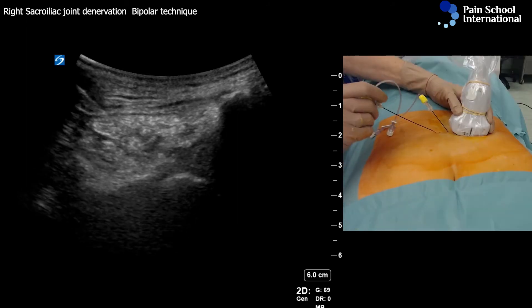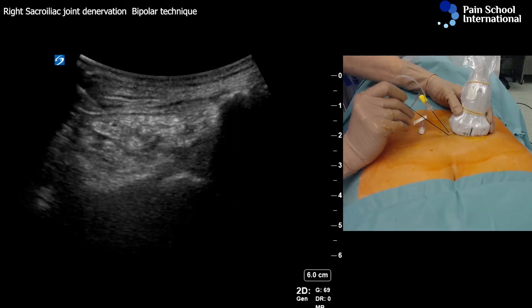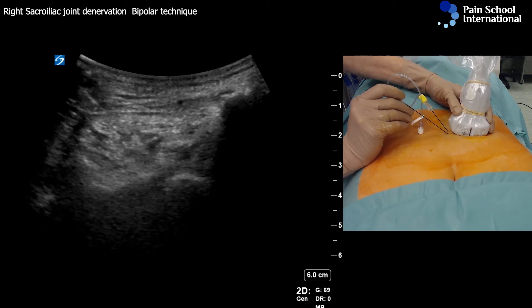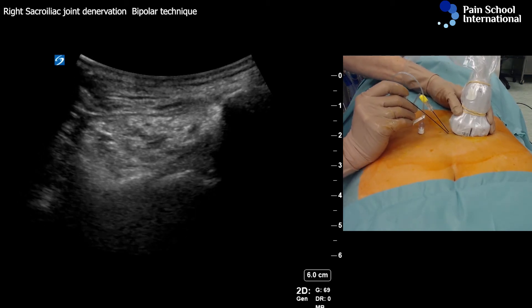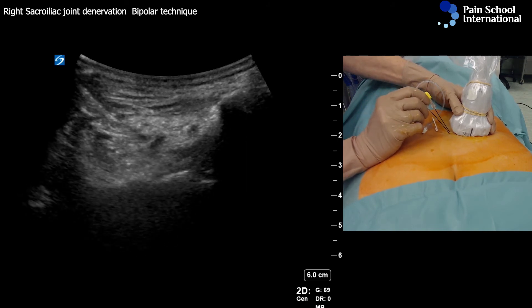I'm placing the second cannula parallel to the first one, about eight millimeter distance, and now I'm targeting the lower outer part of the S1 foramen.